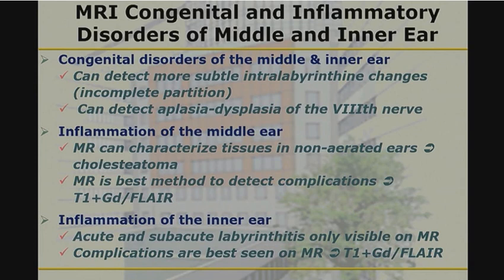But forget about it. Today we have 3D FLAIR. You inject, you wait for 4 hours, and you can see it intravenously. So why the hell would you go intratympanic? We do about 15 patients a week now. So it's a new technique. It's an article from Barak. 4 hours, sorry, I say 4 hours, just 4 hours.